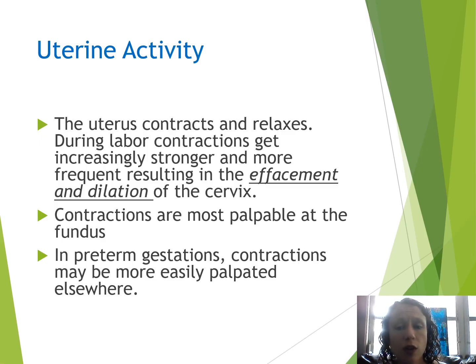When you go into a patient's room and you're doing a head-to-toe assessment, and they're having contractions, we palpate their fundus, the top of the uterus, during a contraction. If we are going up on our Pitocin, we palpate the fundus during a contraction. It's super important that we are assessing what we are causing.